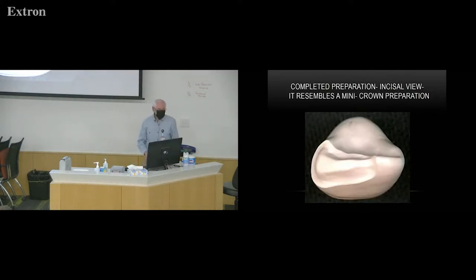So you can just visualize how that composite is really grabbing onto that tooth, and it's not going to let go. Because let's face it, we're putting an incisal edge on this tooth, and we're not telling the patient to favor it. They're going to just chew normally and bite into things. And we don't want our restoration to chip or fall off.